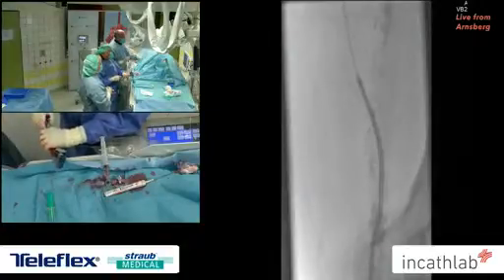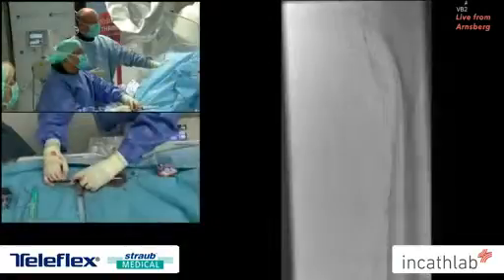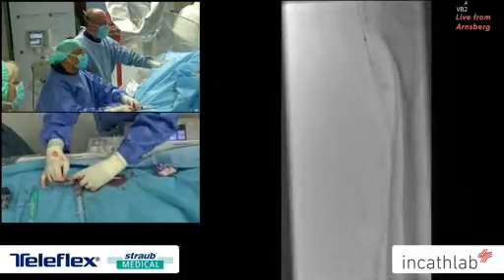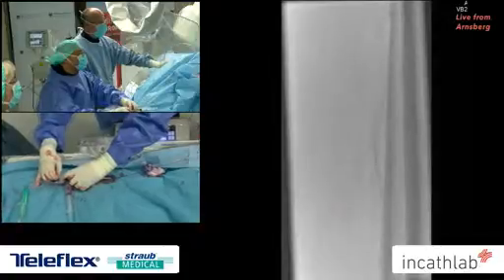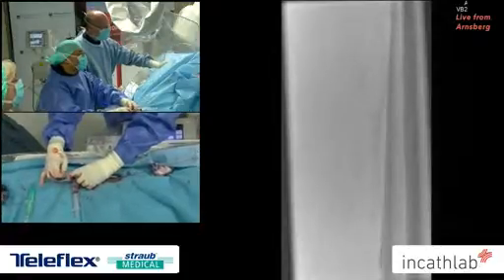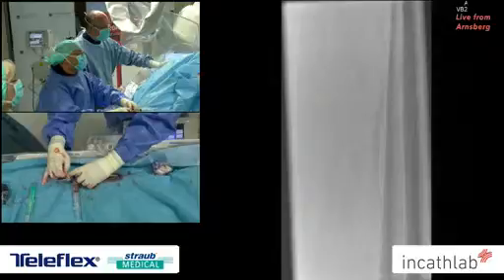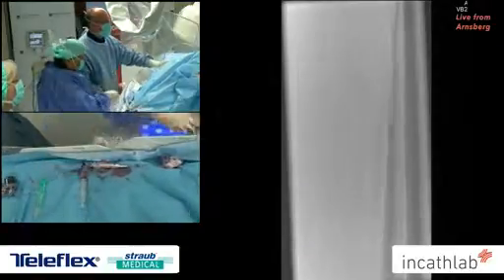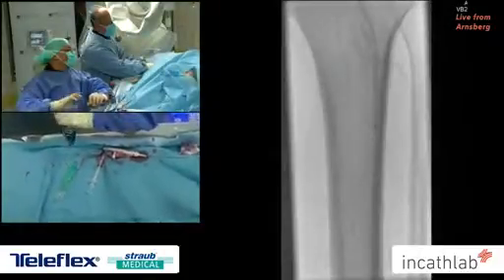And it's running on a 014 wire. Yes, the balloon is running over a 014 wire. There is no limitation in the kind of wire, so you can use a high support wire or high tip load wire, or a hydrophilic wire for navigation.